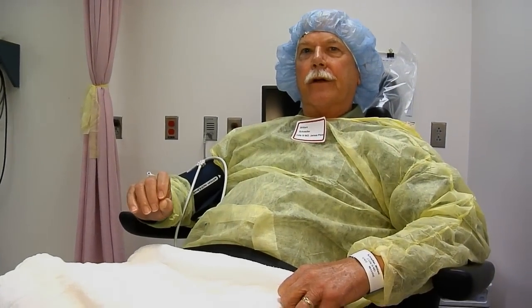My name is Bill Snedler. I'm here to have my right eye treated. They're going to use a laser to remove the cataract and then install a toric lens. I chose bladeless laser surgery because I have pseudo exfoliation. After watching a video on laser surgery, it became obvious to me that there's less tension on the little elements that hold the lens sac — rather than putting a lot of tension on those little pieces that hold that sac in place.